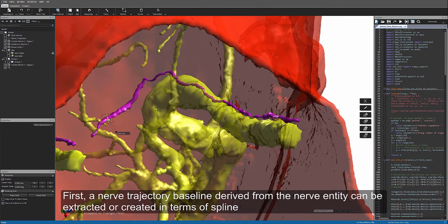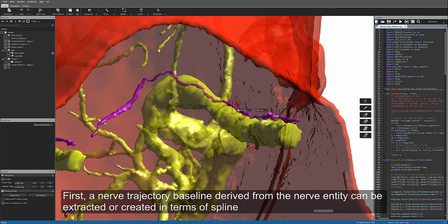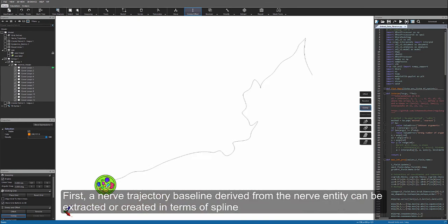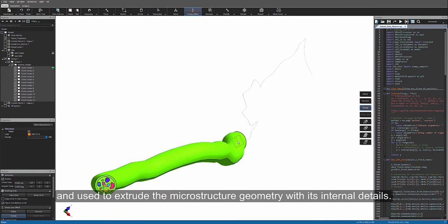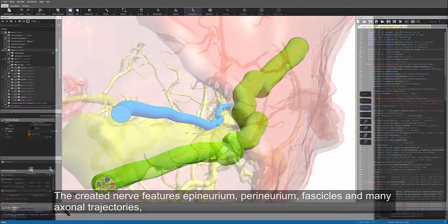First, a nerve trajectory baseline derived from the nerve entity can be extracted or created in terms of spline, and used to extrude the microstructure geometry with its internal details.